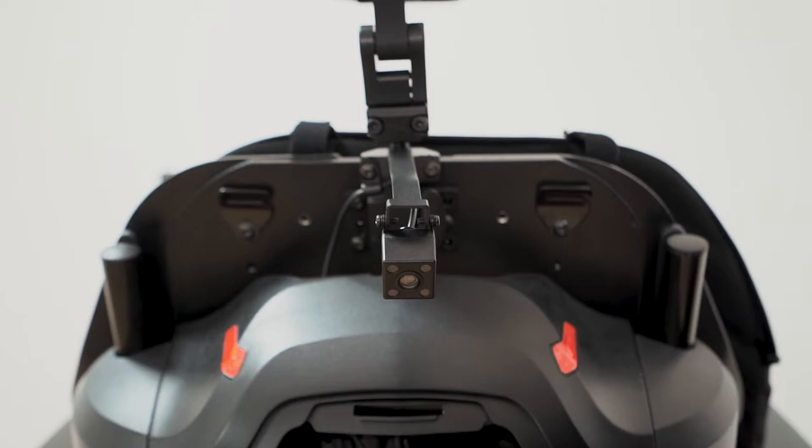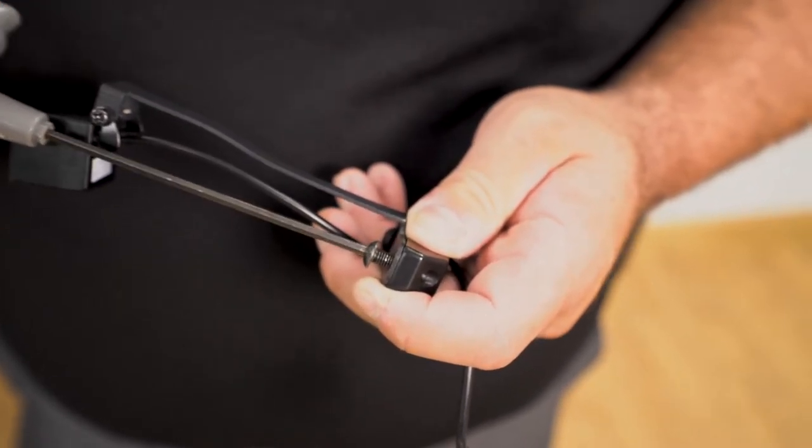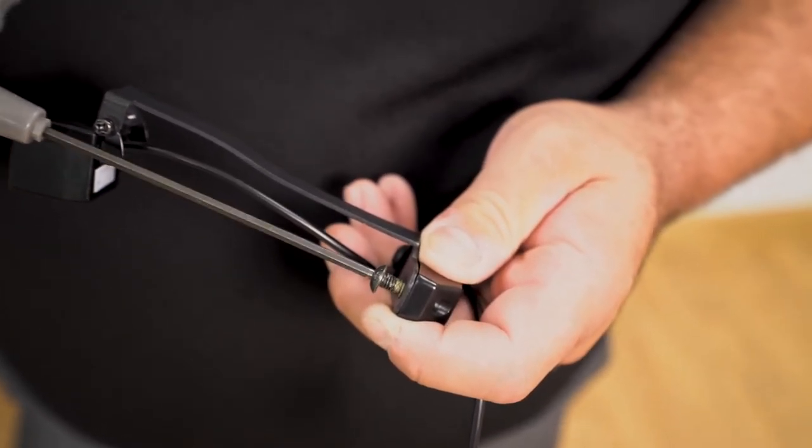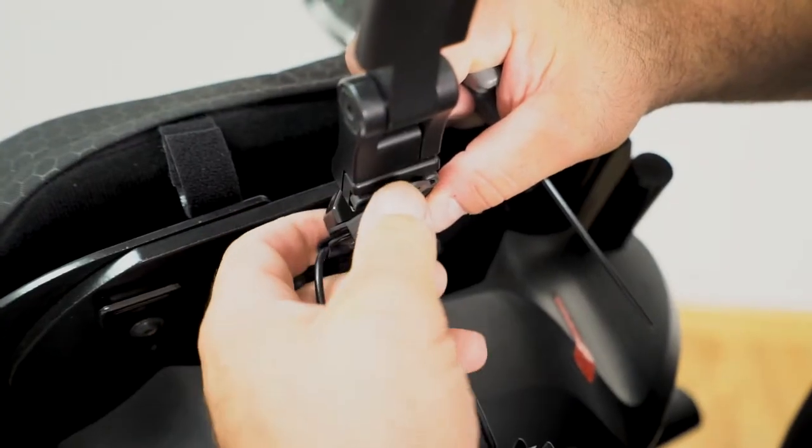We will also demonstrate installation of the rehab headrest camera mount. Next, we can place the bracket on the headrest stem. Start by loosening the bracket with a 3 millimeter hex key, which will allow you to mount the bracket onto the headrest stem.